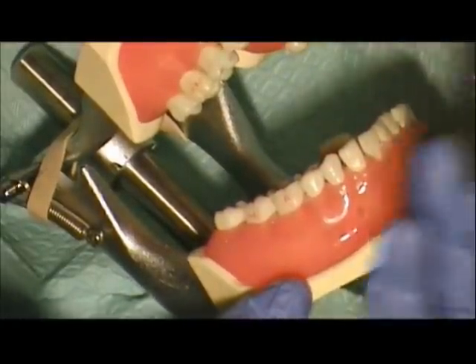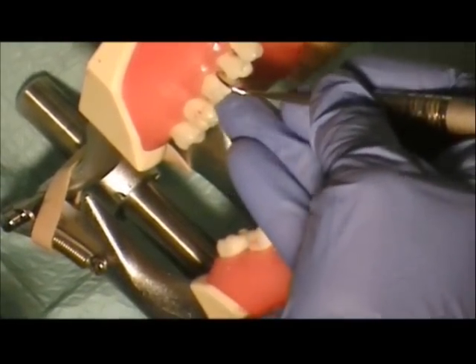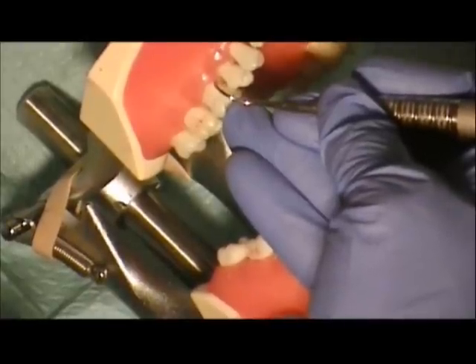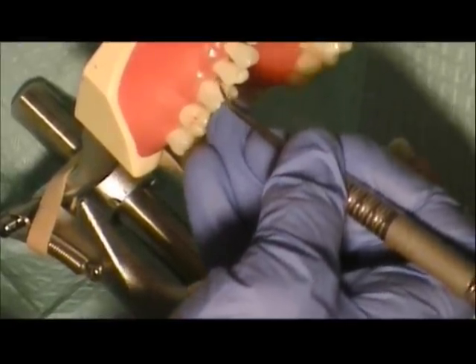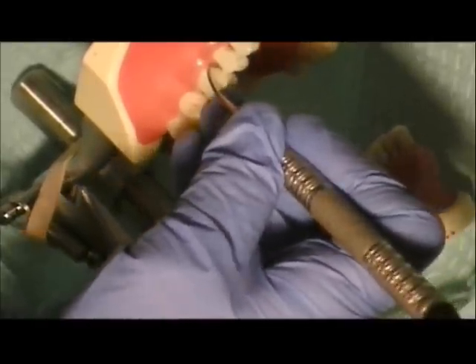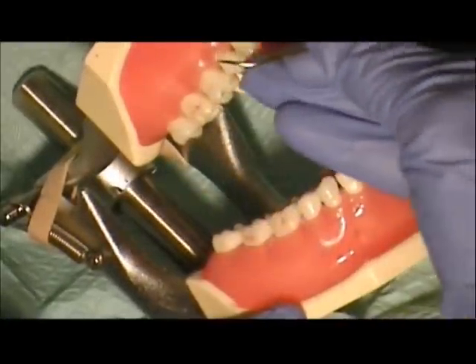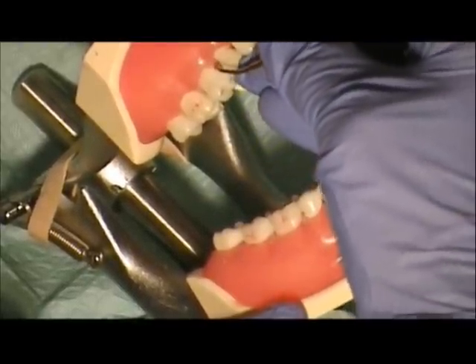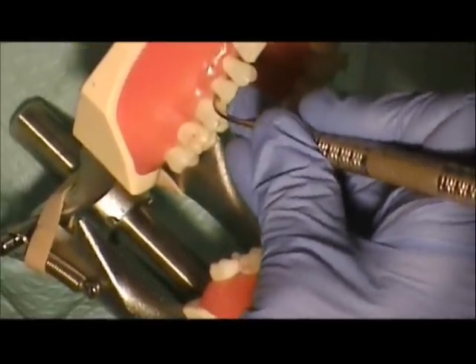On the upper, to determine our correct working end — on the mesial of tooth number 3, you can see the 90-degree face-to-tooth relationship. You want to tip your face to 70 degrees, scaling the mesial in small little bites, going right under the contact. And then from the mesial of 3, you can go right on to the distal of 4. There's our 90 degrees, tip it to 70, and scale into that distal — right under the contact.